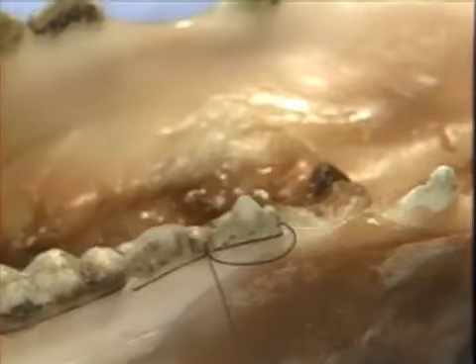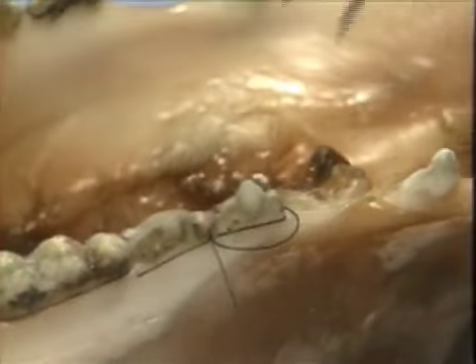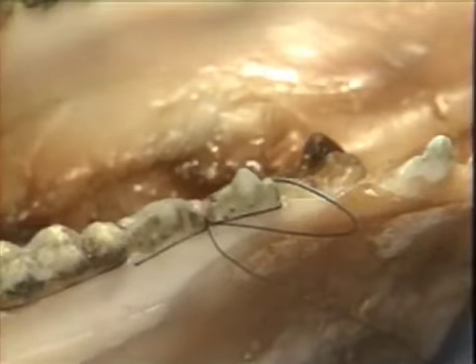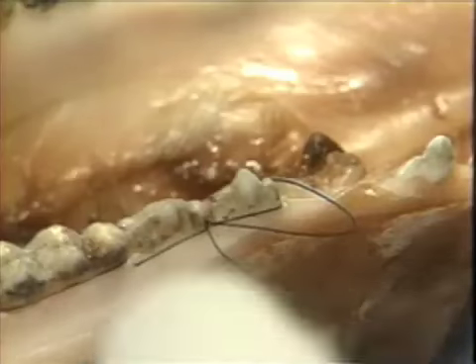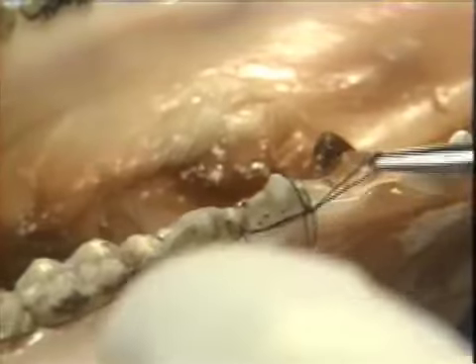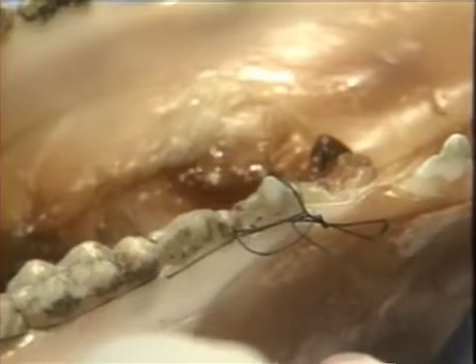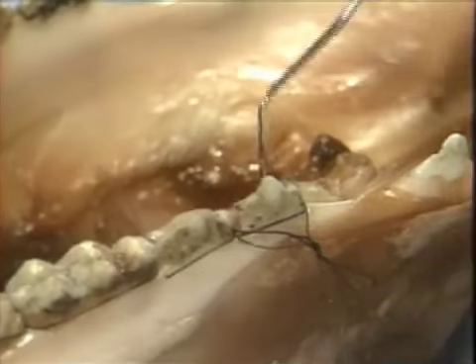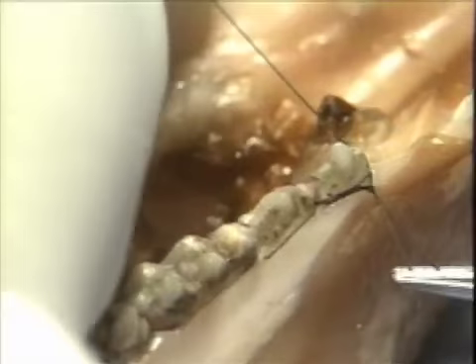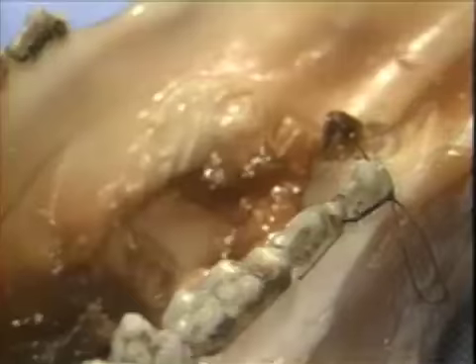Here we can see the suture as it is slung along the buccal surface of these teeth. We will leave a small tail from the final loop on which we will place the final knot, like so. Hence, the lingual flap can be independently sutured. And if desired, the buccal flap can be sutured in a similar way under a different tension and at a different position.